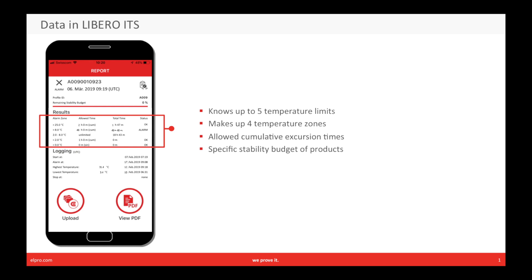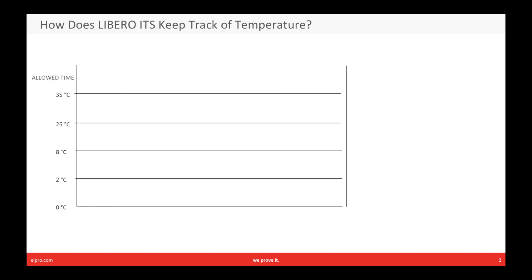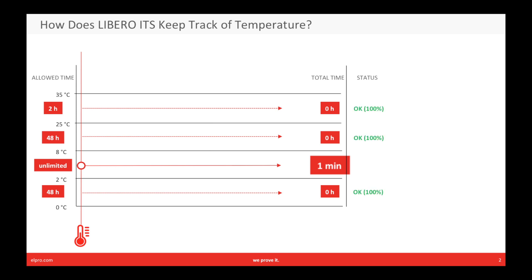Let's see how it works. For each zone, Libero ITS knows the allowed total stability budget. It measures temperature every minute, decides which zone the temperature belongs to, and adds to the total time. Here, we have measured a temperature of five degrees Celsius, which belongs to the good zone. So the statistics after one minute only shows one minute in the two-to-eight degrees zone. The alarm status is still all okay, 100%, and 100% of the total stability budget is left.